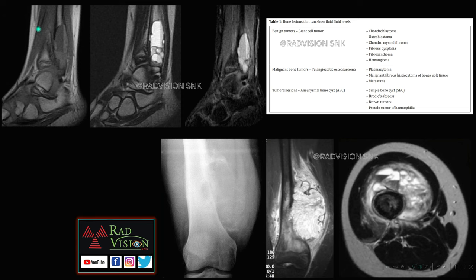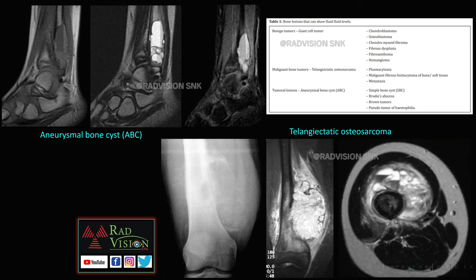A well-defined bony lesion with narrow zone of transition, cortical scalloping, and multiple fluid-fluid levels is a case of aneurysmal bone cyst. A large lesion with wide zone of transition, cortical breach, periosteal elevation, destruction, significant soft tissue component extending into soft tissues and medullary cavity with marrow edema, and multiple fluid-fluid levels — this was telangiectatic osteosarcoma.